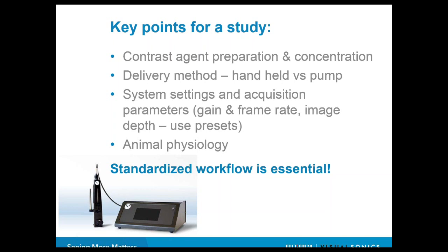Points to consider are, for example, the contrast agent preparation and concentration, the delivery method. In this case, it's been shown that handheld injections have more variation than, for example, if you're using a pump. And if you're interested in using a pump, there's different models out there. There's also one from VisualSonics that can be integrated with the workflow on the 3100, so you have control of the pump settings on the machine itself.